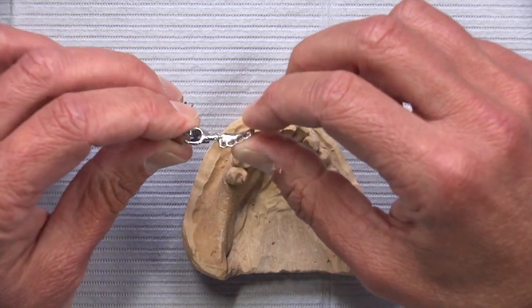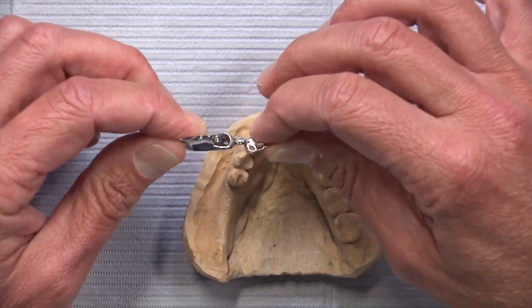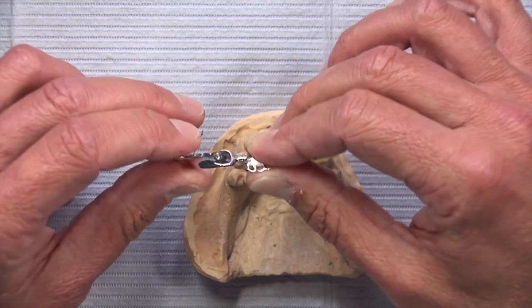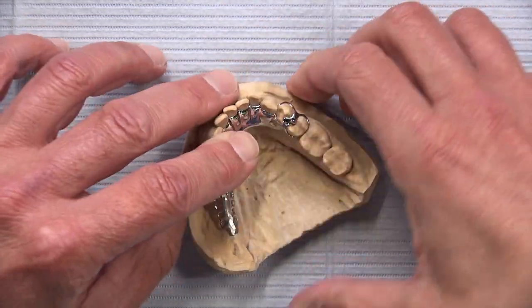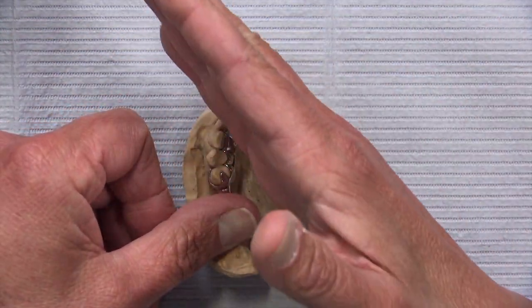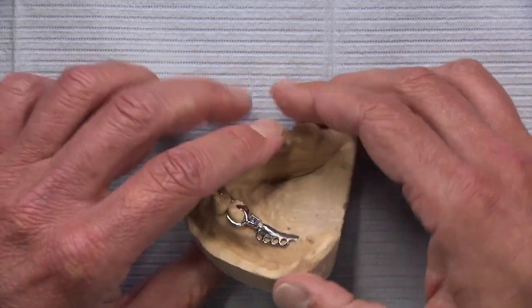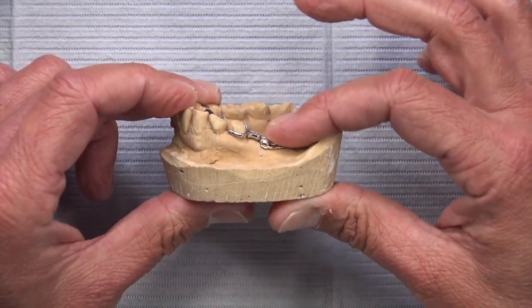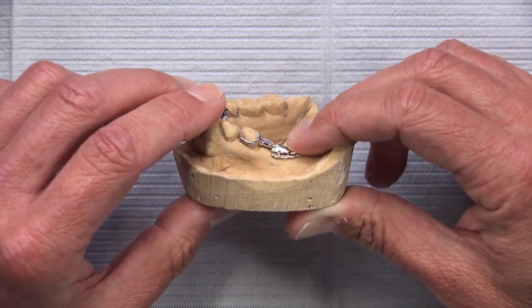This is another situation where a distal extension hinge is going to keep the partial from unseating when the patient bites down. It'll reduce the issue — as the patient loads the denture teeth, the saddle will give into the ridge and not torque the abutment or the partial denture. It's a good use of a DE hinge, so we're not rotating around the axis down the middle with the patient biting on just one side. It gives the saddle the ability to move up and down without torquing the rest of the partial.